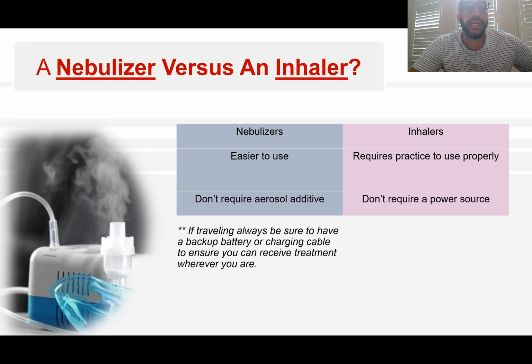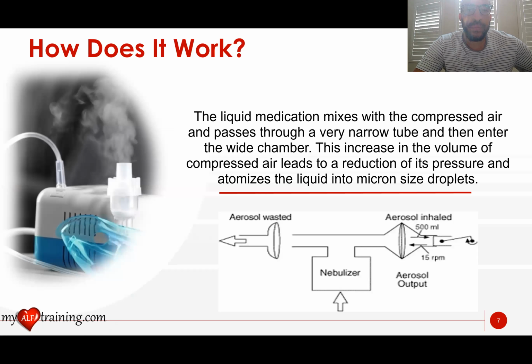And then I put a note here. If traveling, always be sure to have a backup battery or charging cable to ensure that the patient can receive their treatment wherever they are, if they have a nebulizer. So even if you're walking with your patient somewhere, you want to always be sure that if they pack that nebulizer, it's either charged before you go, or, if it's not battery operated, you have the charging cable or a backup battery to attach to it. Okay.